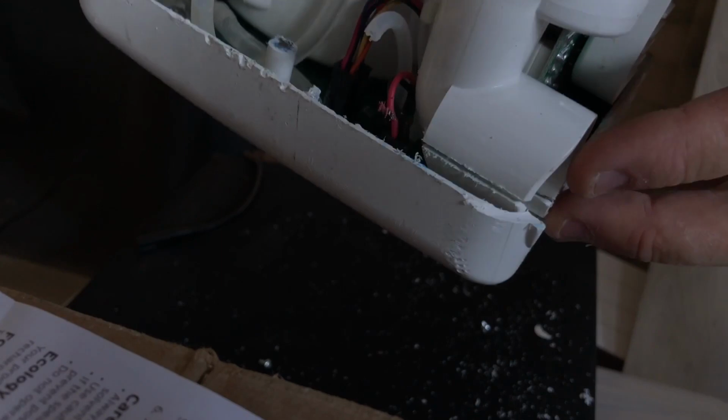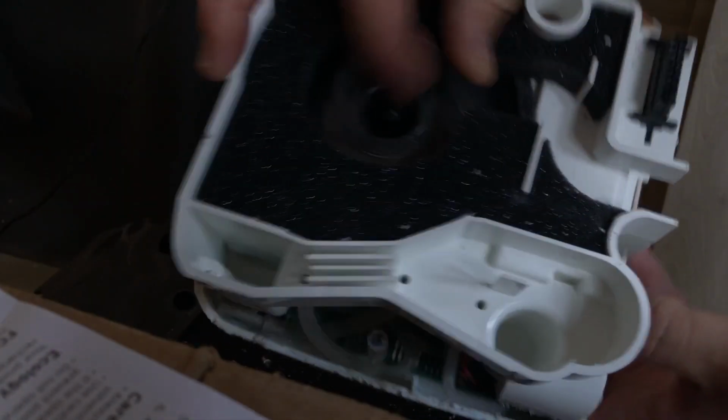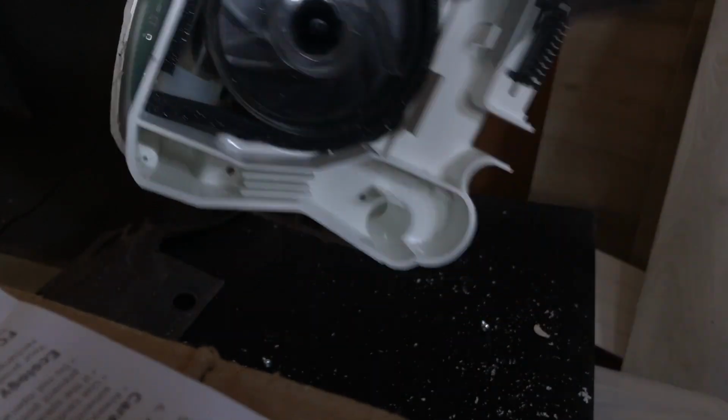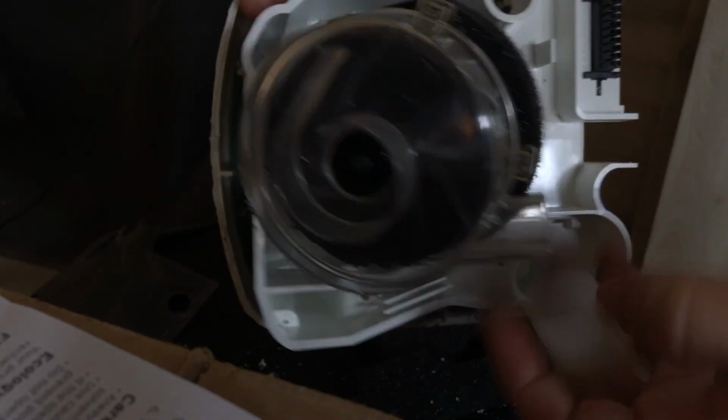And I can actually get to some of these other ones, I think, to maybe open up the rest of this thing. Okay, there's a pad on the bottom here. This is the fan, or the air chamber. You see this thing that's right here? Let's open it up. You can see that's the motor. It's on a vibration resistant mounting here. You can see it's all padded around, and basically that's it. That's the blower motor.